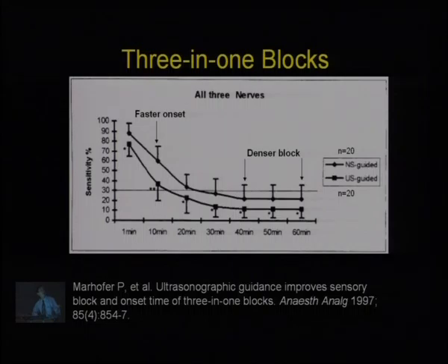Using ultrasound, the onset is around 10 minutes, whereas using a nerve stimulator-guided, the onset is delayed to around 20 minutes.